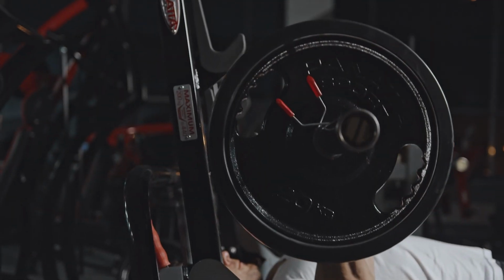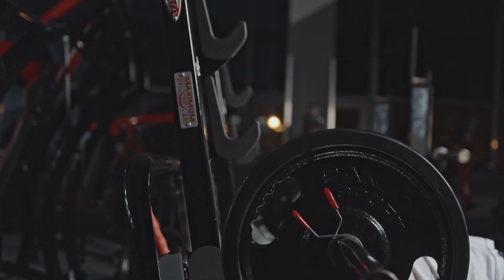A measure often used in EMG is the maximum voluntary contraction, MVC. The MVC is the maximal force generating capacity of a muscle or group of muscles. The MVC is used to measure and evaluate muscle strength and provide physiological references.